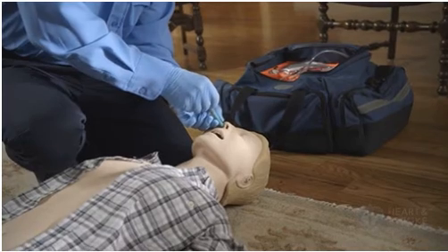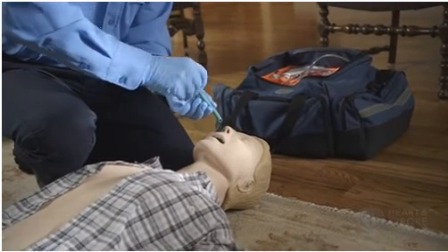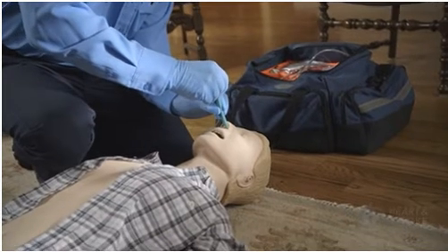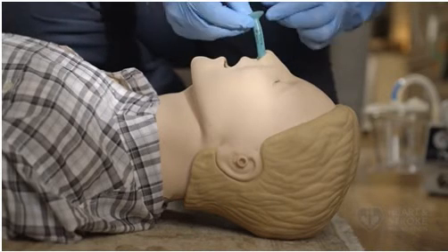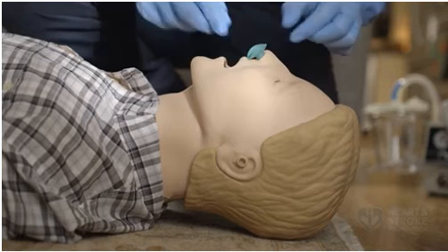If you continue to encounter resistance, withdraw the airway completely. You may try inserting it in the other nostril. Use caution when inserting the NPA in patients with severe head or facial trauma because of the risk of misplacement into the cranial cavity. With a known basal skull fracture, an oral airway is preferred.